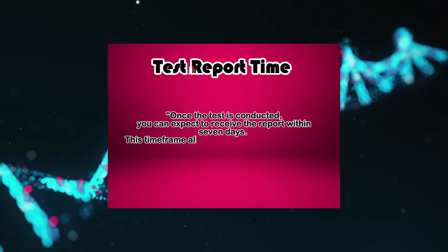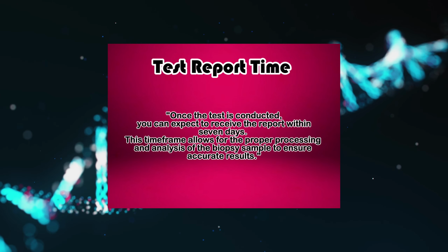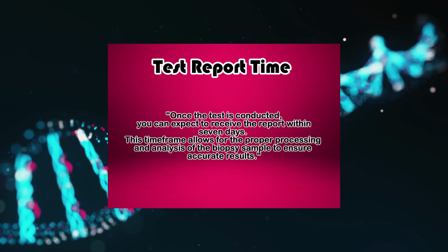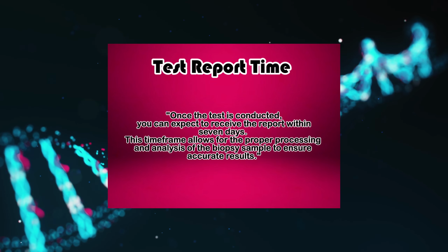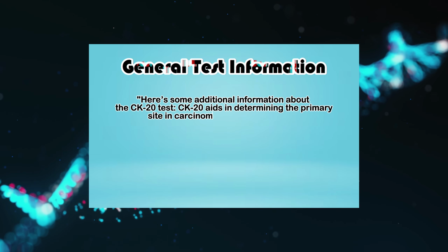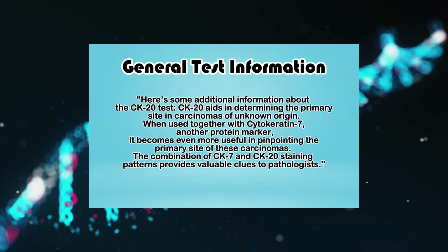Test report time. Once the test is conducted, you can expect to receive the report within 7 days. This time frame allows for the proper processing and analysis of the biopsy sample to ensure accurate results. General test information. Here's some additional information about the CK-20 test.